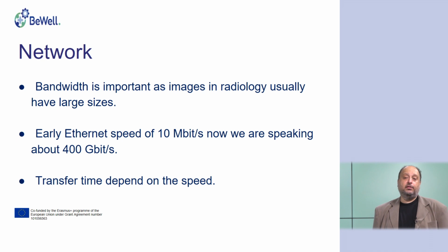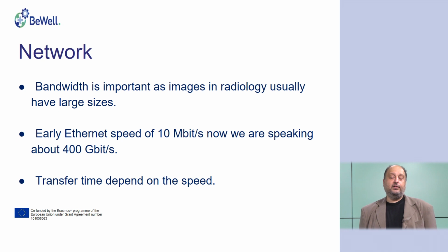So once again, the PACS is software plus some other systems, but most of the hardware is often not considered as the PACS. So if you purchase the PACS, do not expect to have modalities and network included in it. Or sometimes you may have to purchase the servers additionally.